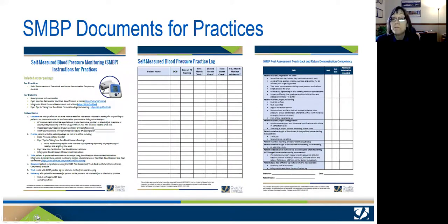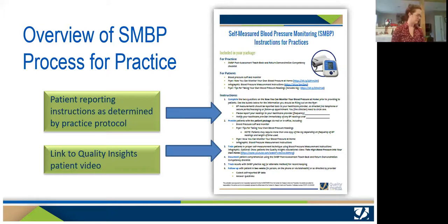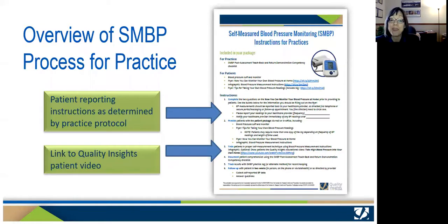We have 3 documents that are for practices in our resource package, and we will go through them all quickly. The first is the overview. It contains an overview of things that we'll be talking about today, the documents for you, the documents for patients. I do want to point out 2 things. The first is a place for you to make sure that your practice protocol is consistent, or that you've identified how and when you want your patients to record and bring back their measurements, when you want them to return to the office, or whatever it is that is your protocol.